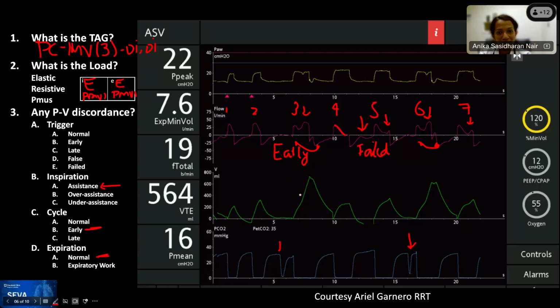And we'll just, Rob, let me know if anything comes up in the chat. Ariel knows. He says it depends on the mode. Do you want to keep ASV? Well, that's the question, isn't it? Yeah. Right. So we'll start with one step simpler than that too. It kind of depends on the goal. But let's say that our goal is comfort here. What would we want to do about it?